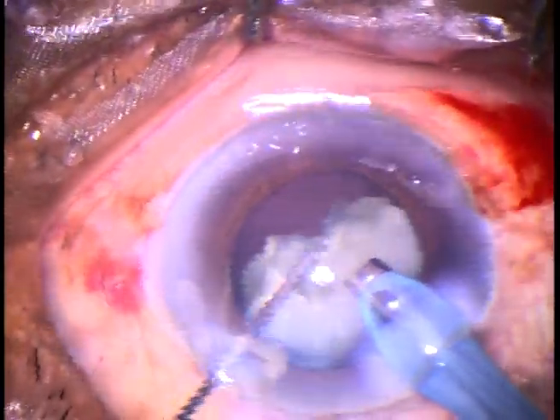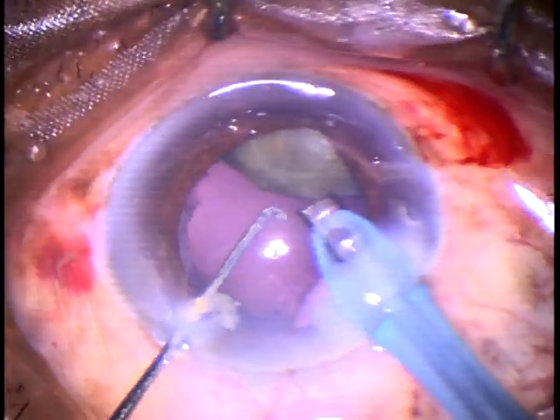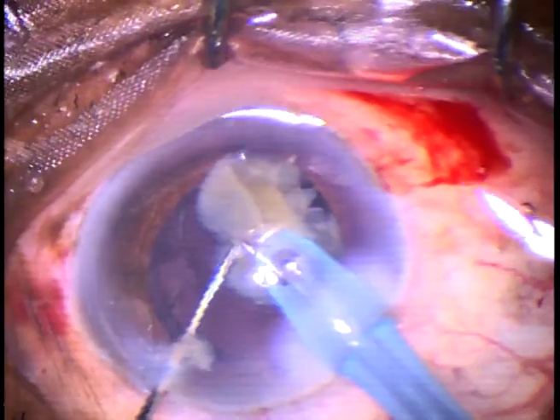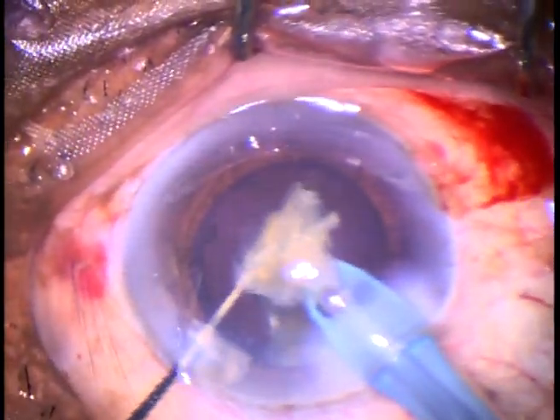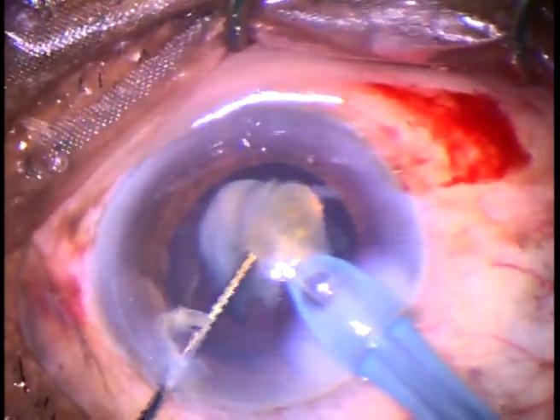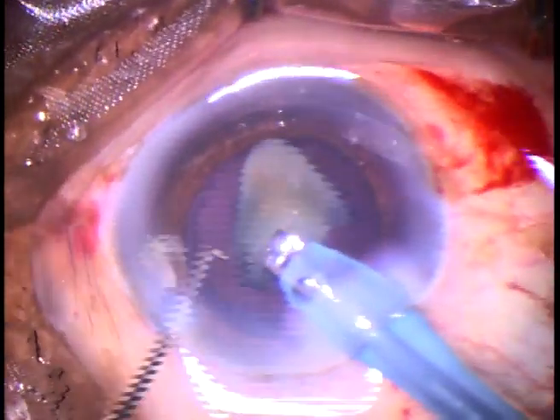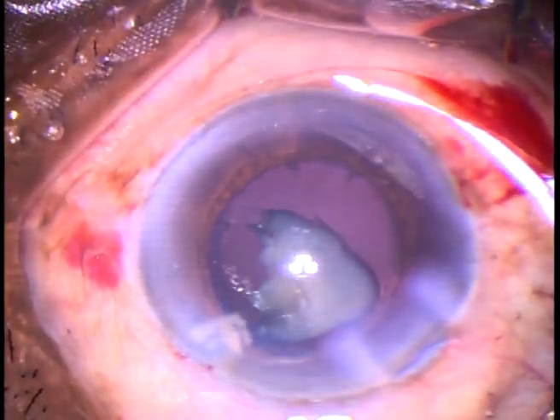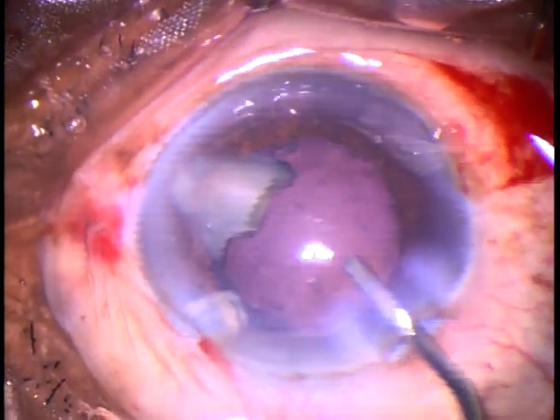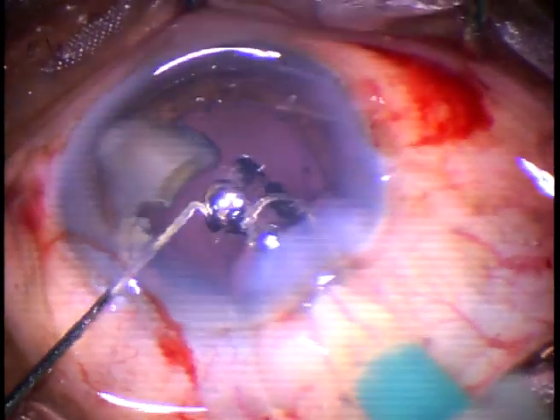This is the last nuclear piece and it is quite big. My plan is to divide this big piece into smaller pieces, and the last piece I will not emulsify. At any moment, one piece is down protecting the posterior capsule, and the other piece just above that is being emulsified. This is the last portion that I am going to leave here — I will not emulsify this. Just come out, inject visco — 2% hydroxypropylmethylcellulose. Since this is a small piece, it goes inferiorly. An intraocular lens is now placed in the capsular bag.